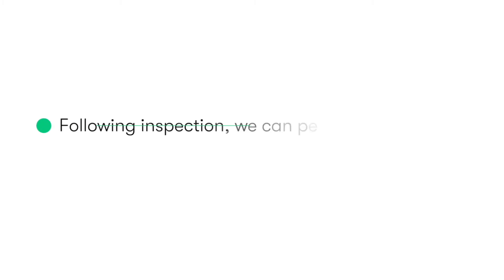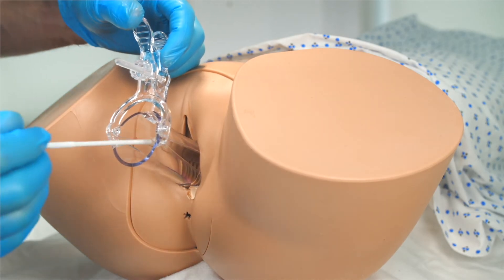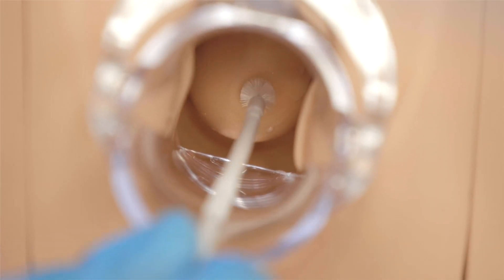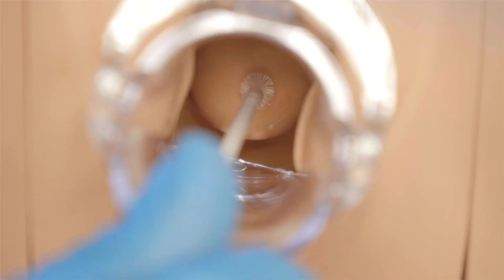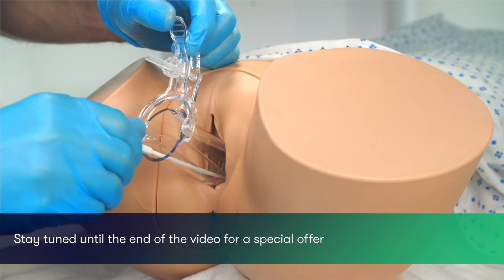After inspecting the cervix, we are now able to obtain the cervical screening sample, or the smear sample. We take the endocervical brush and introduce it through the speculum and into the endocervical canal. With the brush positioned in the canal, we rotate the brush a full 360 degrees, approximately five times, in a clockwise direction. This process allows us to sample the cells in the region, which can then be analysed under cytology to look for signs of HPV-related changes.